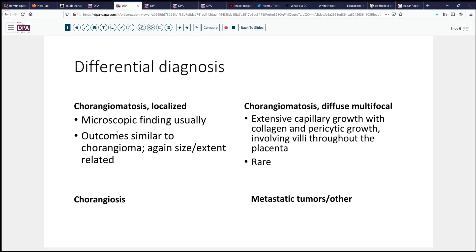Chorangiomatosis localized is usually not identified grossly — it's usually a microscopic finding. But again, some of the same outcomes in terms of preeclampsia, preterm birth, and so forth, are related to the size and extent of these lesions. The diffuse multifocal chorangiomatosis is associated with very dense collagen and pericytic growth, involving villi throughout the placenta rather than being a localized phenomenon, and is rather rare. Chorangiosis is again a microscopic description based on numbers of capillaries. The less frequent lesions would be metastatic tumors, vascular tumors, and so forth.